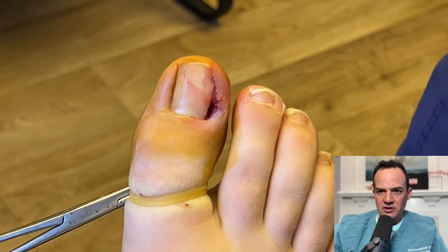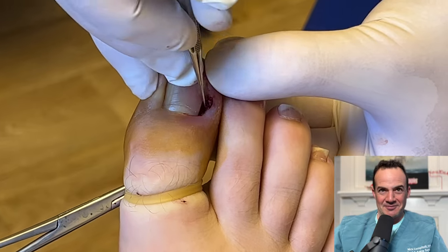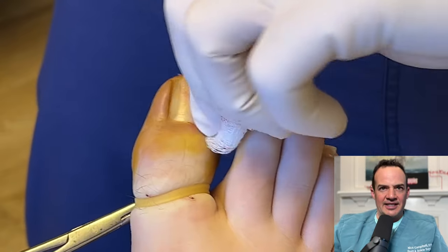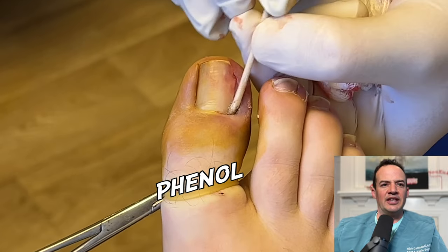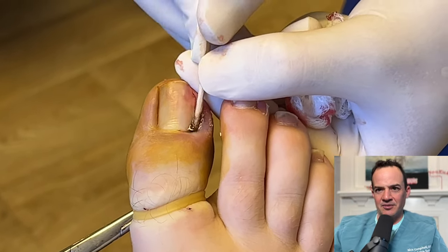If we can't get it out manually, we'll use an instrument called a curette, which my staff sometimes refers to as a melon baller because it kind of looks like the device we use to cut watermelons or cantaloupe with. And now you can see we're putting in the chemical called phenol, which will destruct the cells that grow the toenail and prevent it from coming back.